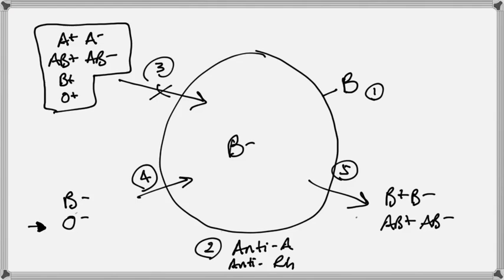When you are learning this blood typing activity, please do not try to memorize. You have 8 different blood types, 5 different questions. That's 40 little tidbits of information. And trust me, that becomes very, very difficult to memorize, a bunch of little negative and positive signs and ABs and Rhs. So I really encourage you to draw out the circle, think through the questions. If you work through this logically, you'll always get the right answer. If we try to memorize this, if you're like me, your memory will fail. And so you'll end up killing somebody, to be very blunt.